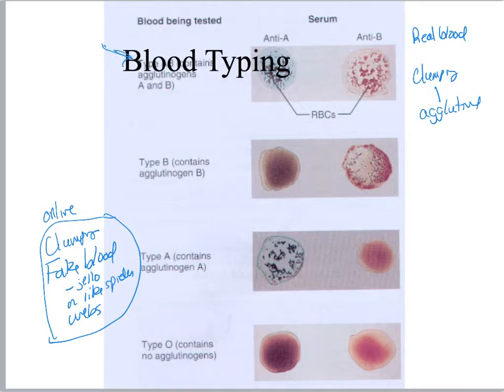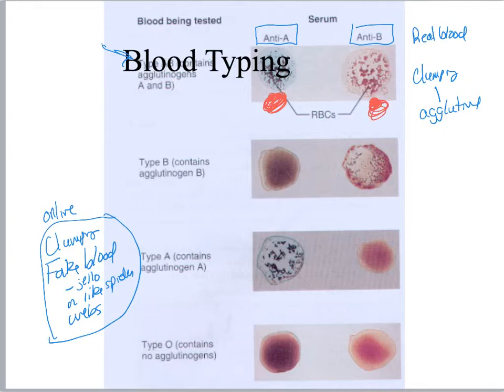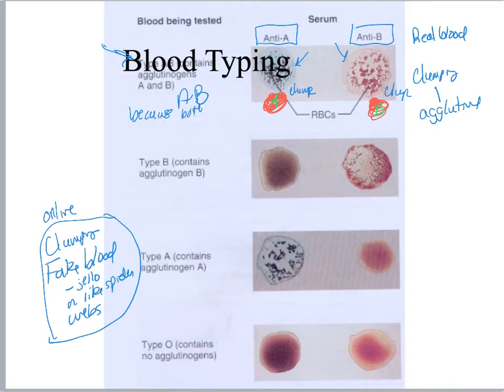I've got my slide with a column for anti-A and a column for anti-B. They put a drop of blood in each, then a drop of anti-A serum here and a drop of anti-B serum here. You will notice that both clumped — the anti-A serum bound to A antigens and the anti-B serum bound to B antigens. That means this is type AB blood because both clumped.